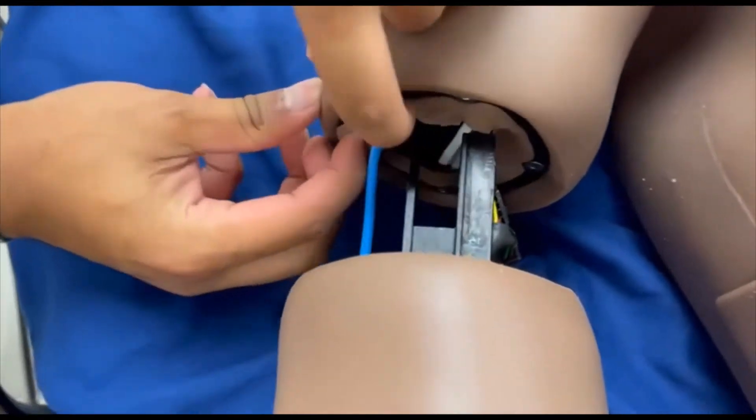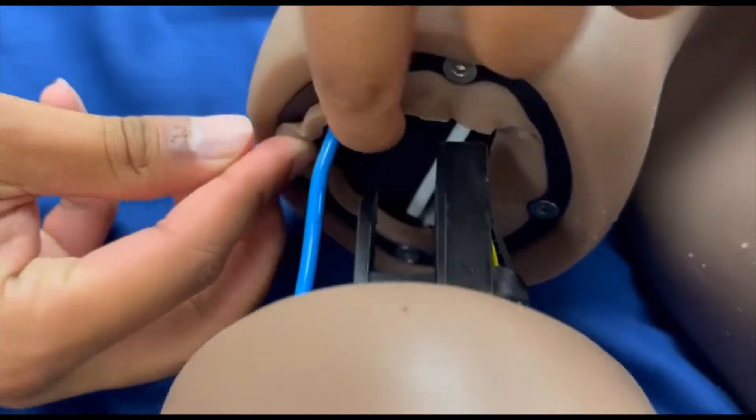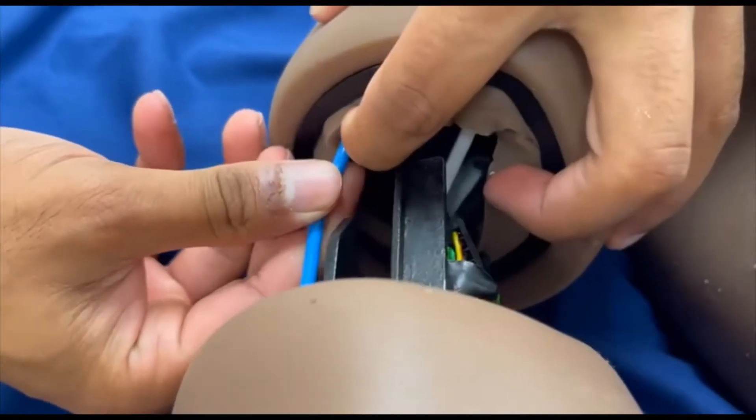To remove the blue tube, you will see a blue ring. The blue ring is also a button, so press it and gently slide the blue tube out.